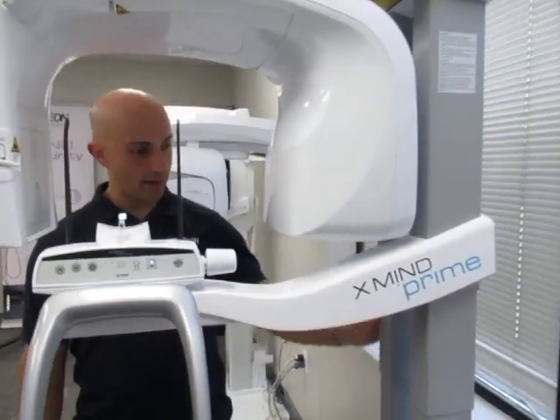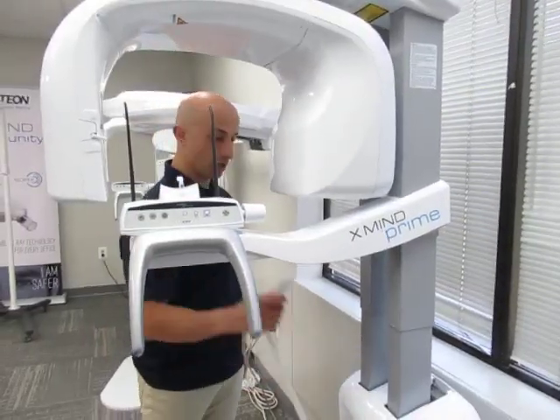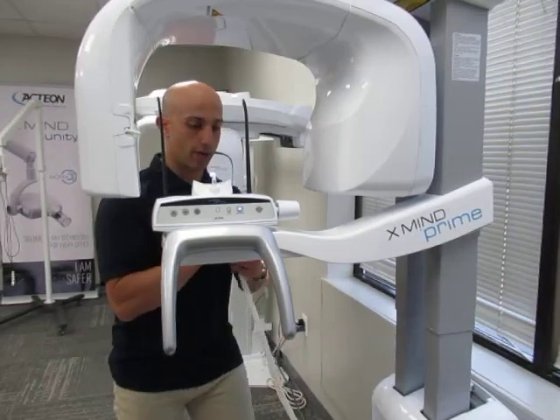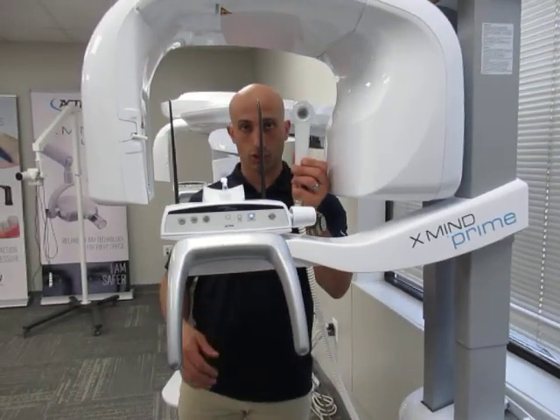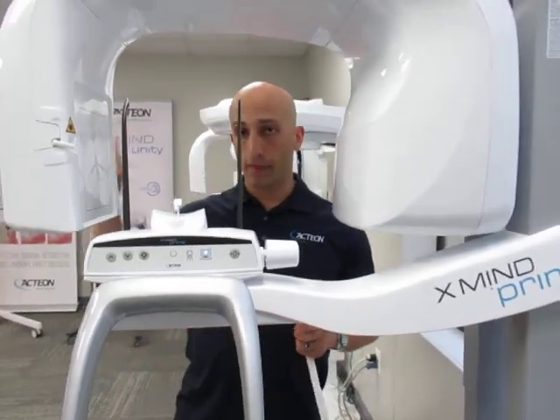This gray apparatus here is called the column — it's going to adjust to the patient's height. And then you have an exposure wand. You may either have this bungee exposure, which will extend 16 feet, or you may have a button on your wall.